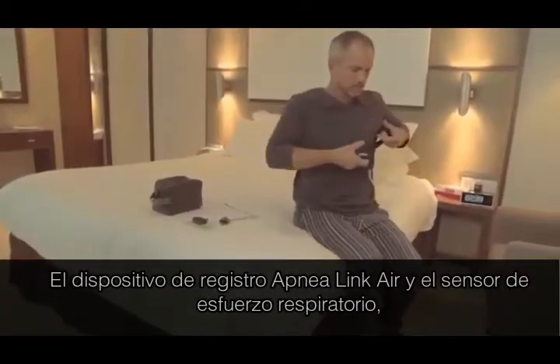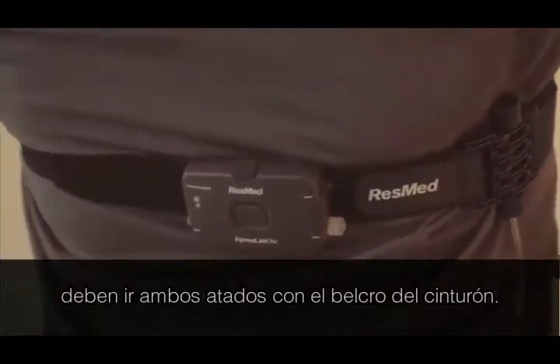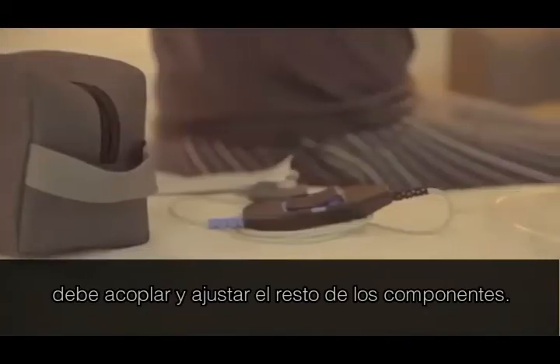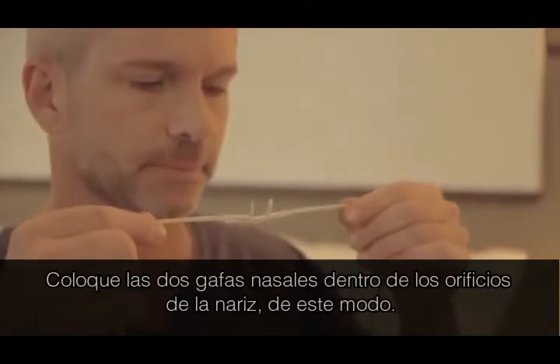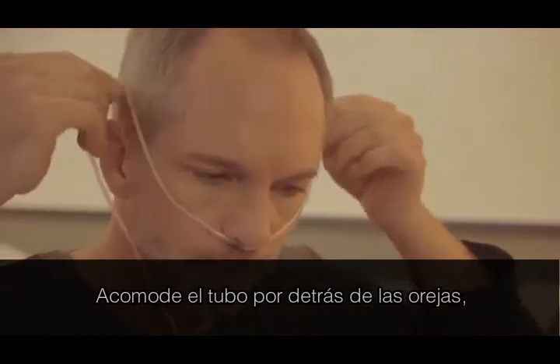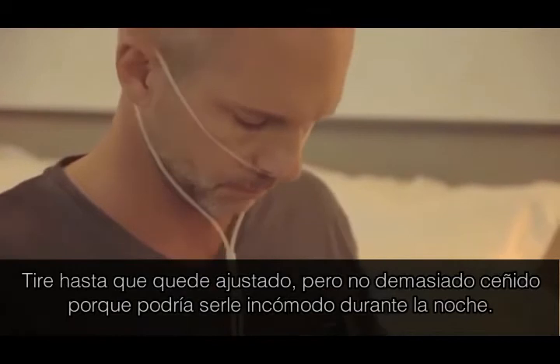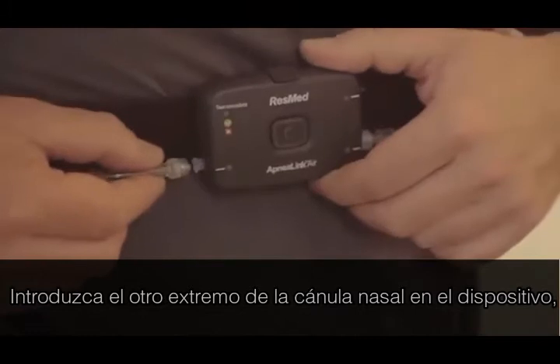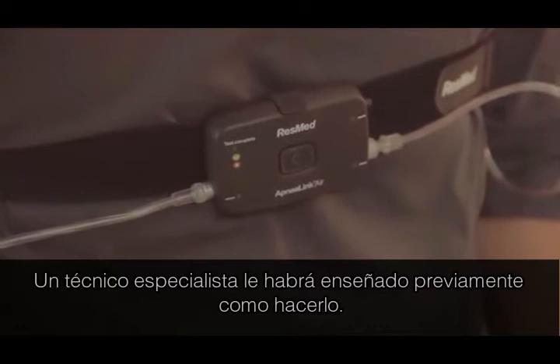The ApneaLink Air Recorder and effort sensor will most likely already be attached to the Velcro belt supplied. Before you go to bed for a normal night's sleep, you need to assemble and attach the components. Take the nasal cannula, which measures airflow, with the two prongs facing downwards, like this. Loop the tubing over each ear and tighten the toggle under the chin. Make it snug, but not so tight that it's uncomfortable. Insert the end of the nasal cannula into the recorder, turning it clockwise. Your health care provider may have already done this for you.